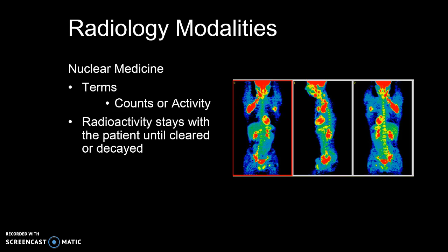Nuclear medicine uses small amounts of radioactive material to diagnose and treat. The patient will be radioactive until the radiation therapy is cleared for the patient, so patients should be cognizant when near children or pregnant women.